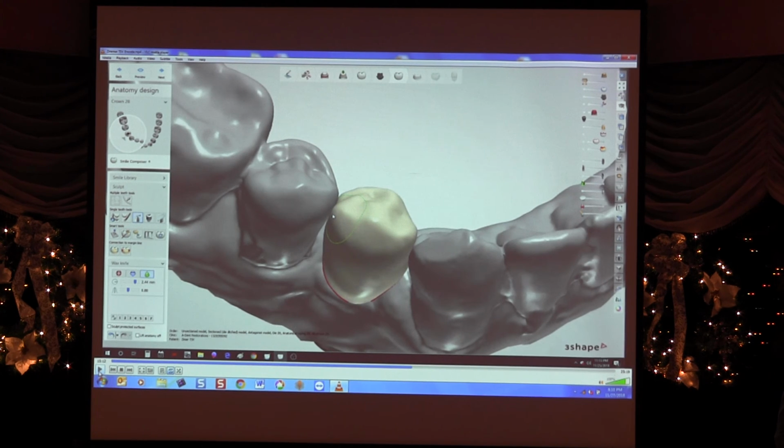So I don't want anybody to ever think that I think we're ready for modelless dentistry. Because if I want my facial cutbacks, like I showed you before, I have to have a model for him to layer that porcelain on there. If I want to do copings and do a full porcelain, I have to.